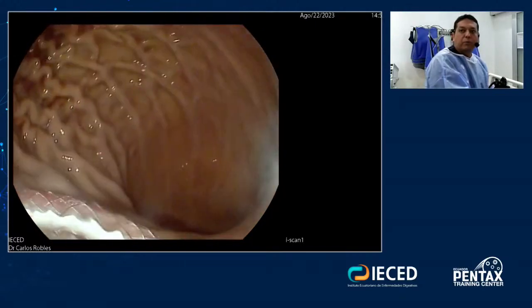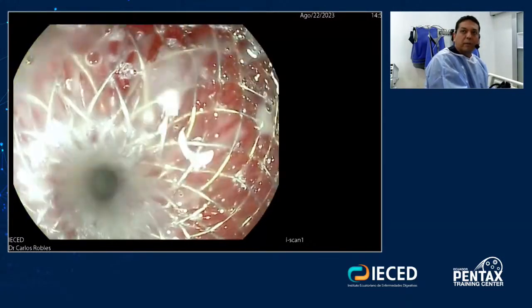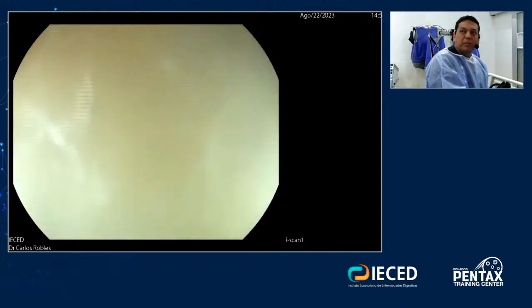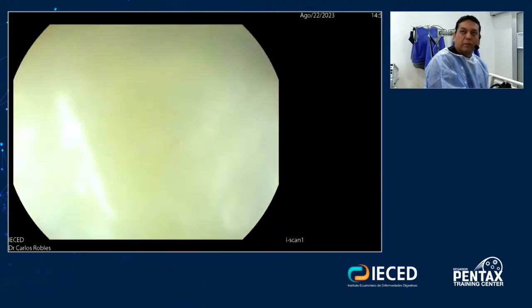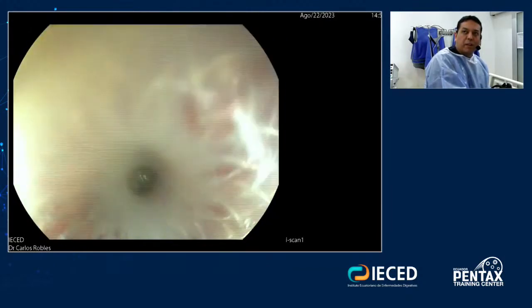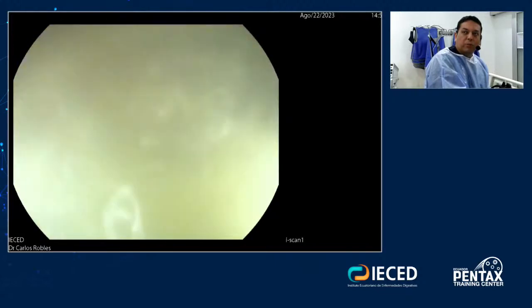And I love to go inside. No, not inside, but just to do an aspiration. You see here, huh? If you want, you can send to culture this from the needle. When you do it, this is another advantage sometimes to do it when the patient have fever, to use the needle. But moreover, when you try to go inside and the pseudocyst wall is very hard, it is very difficult to go through. So sometimes it's better to go through the guide wire, guided by the guide wire.